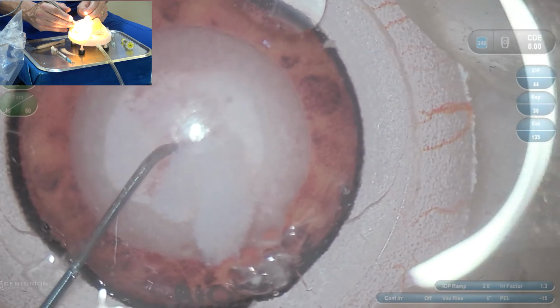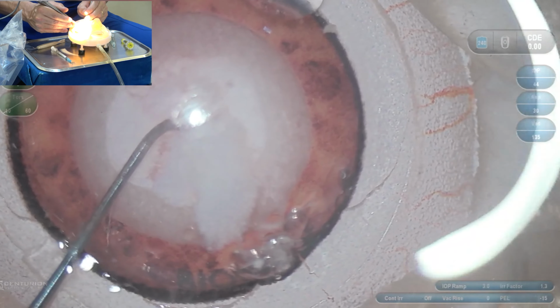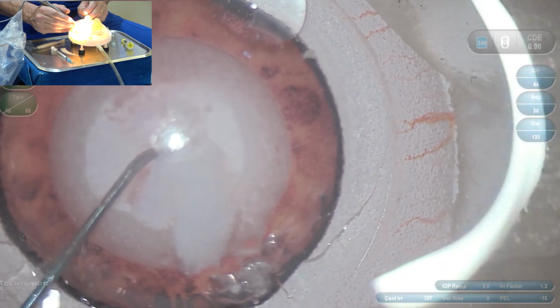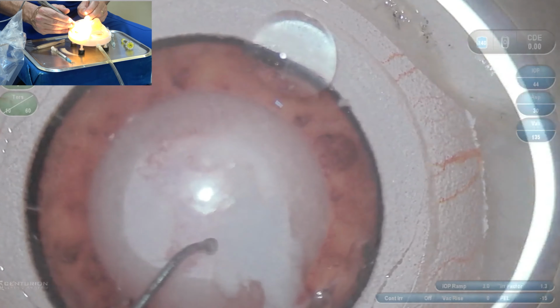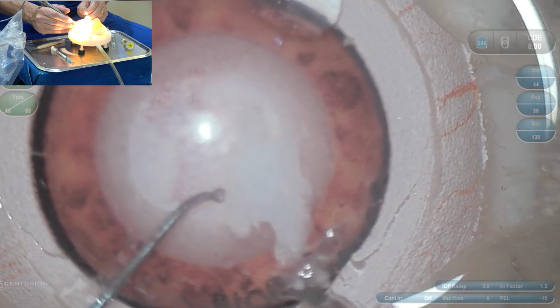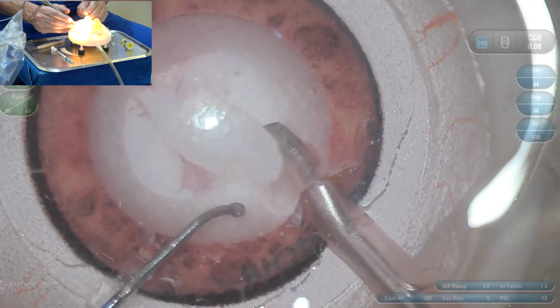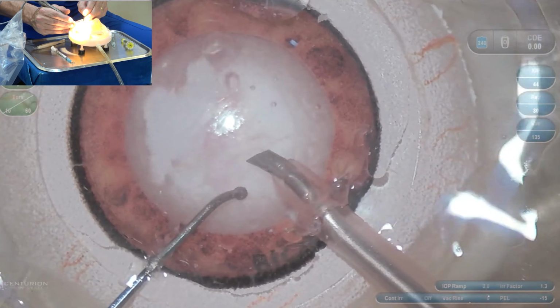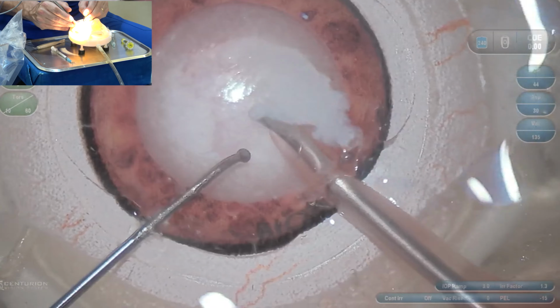Okay, perfect. So now we have the last half of the lens, and I would love for you to understand the chopping technique. The chopping technique is to go to the fragment, position 2, you see the vacuum rise, position 3 a little bit, then you bring it, and then you put the second instrument behind, and look at that. Then you have the chopping maneuver.